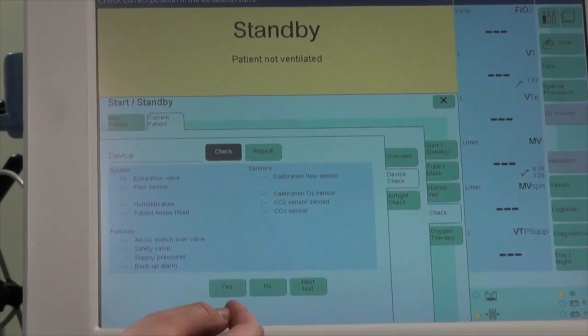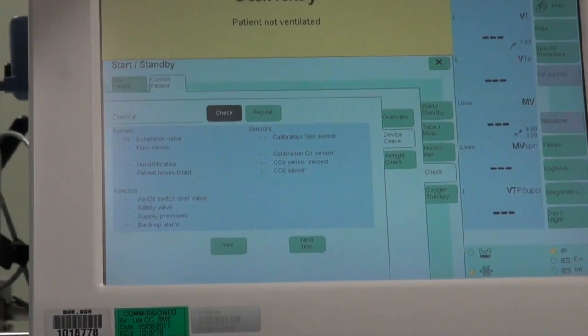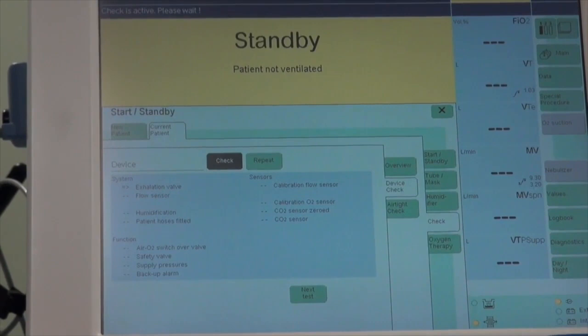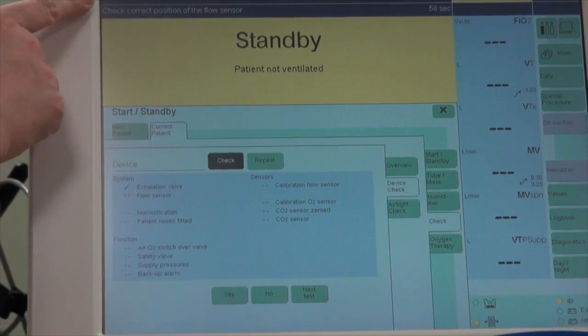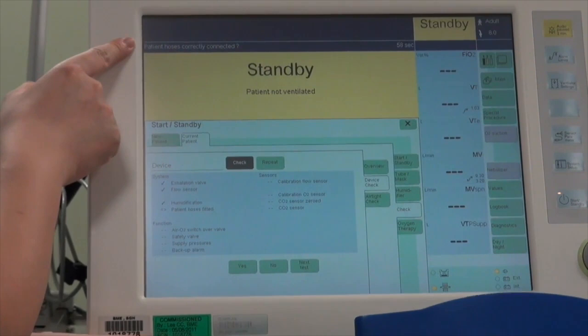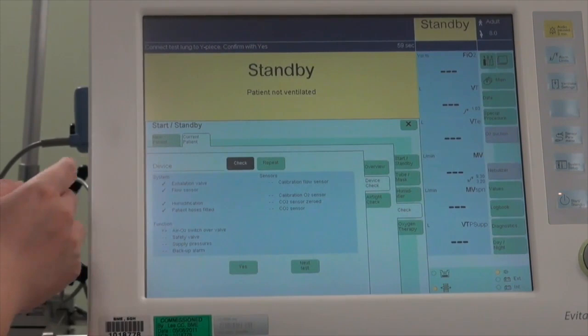The first test is to check the correct position of the exhalation valve — click Yes. Connect test lung to Y-piece and confirm with Yes. Next, check correct position of the flow sensor. Then confirm whether the HME filter is ready for use, and confirm that patient hoses — inspiratory and expiratory — are correctly connected. Connect test lung to Y-piece and confirm with Yes.